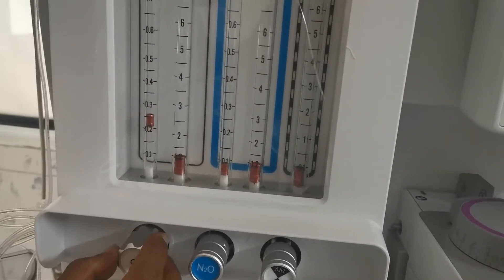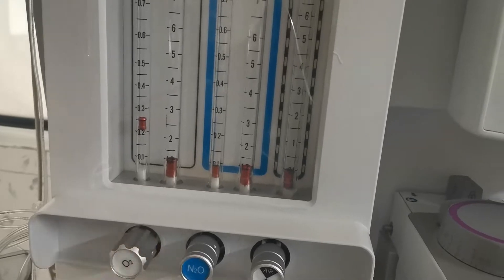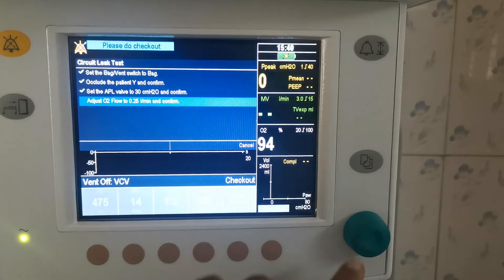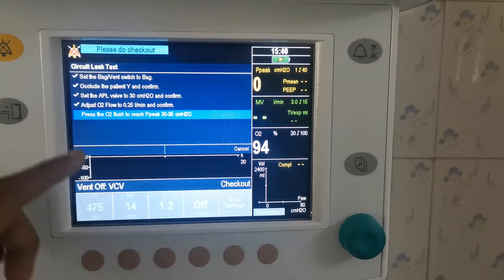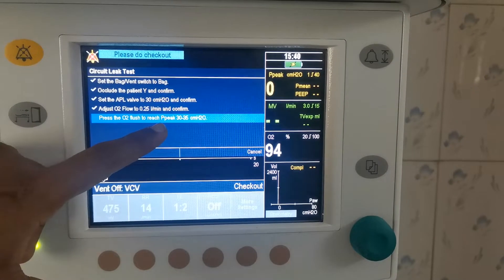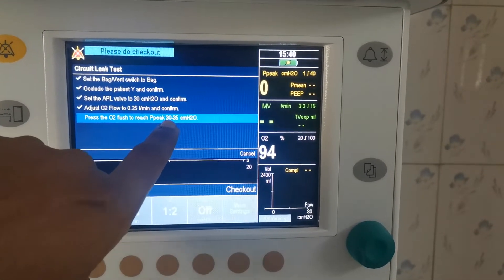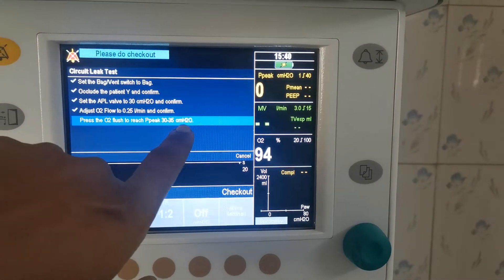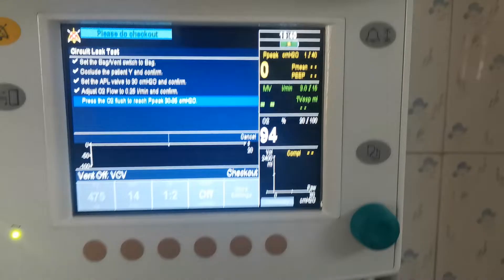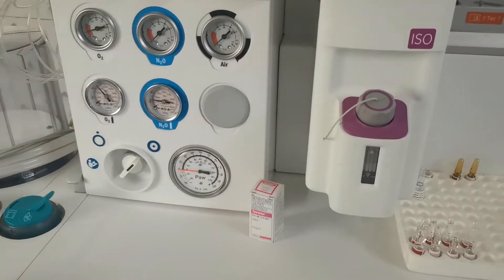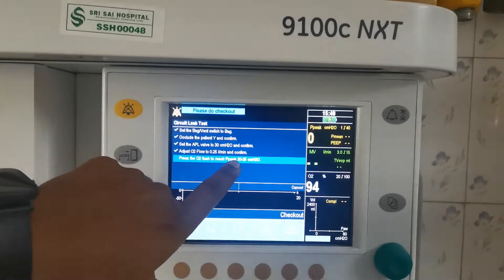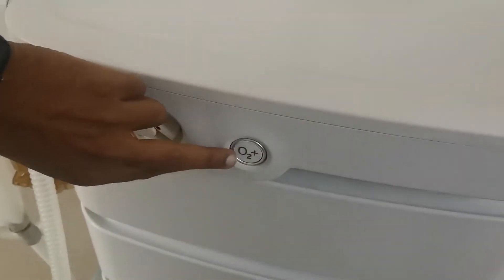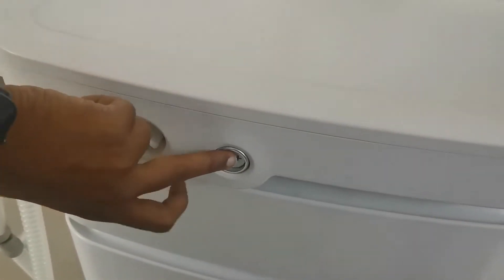0.25. Then press the O2 flush to reach pressure to 30-35 cmH2O — this is 4, you have to adjust to 30-35. This is the O2 flush button, so you press it.